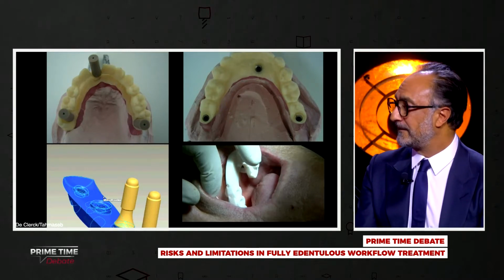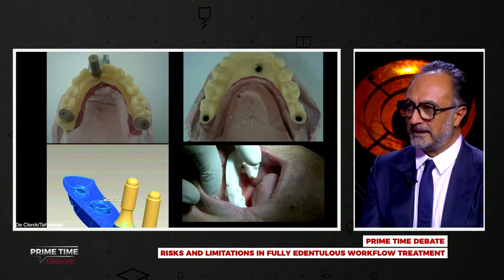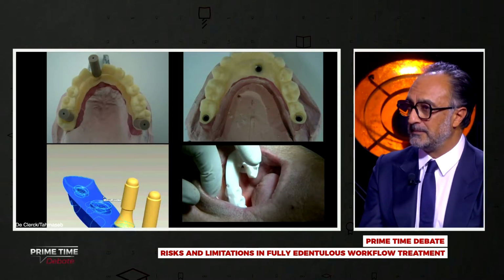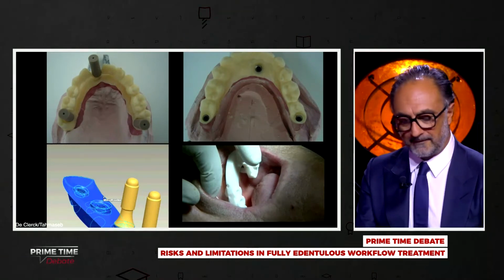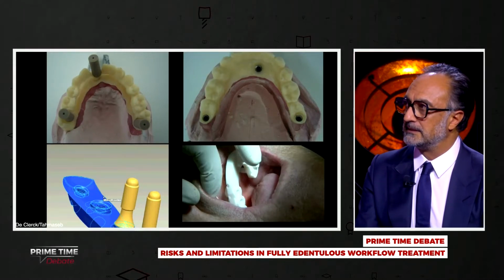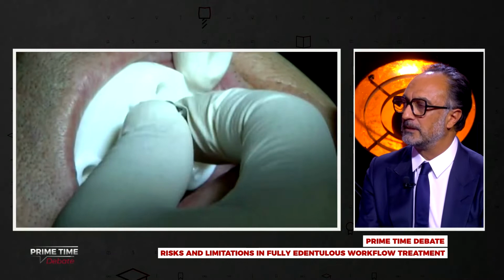It's also a very simple surgery, and I think at least you have to give that also as an option to the patient. And if you explain it right, and if you say it has a lot of benefits, why not? I mean, you can still use it. The patients that we treated during our program when we did the study back in 2012, none of them really had any problem to have those mini implants stay if you explain them in the correct way.